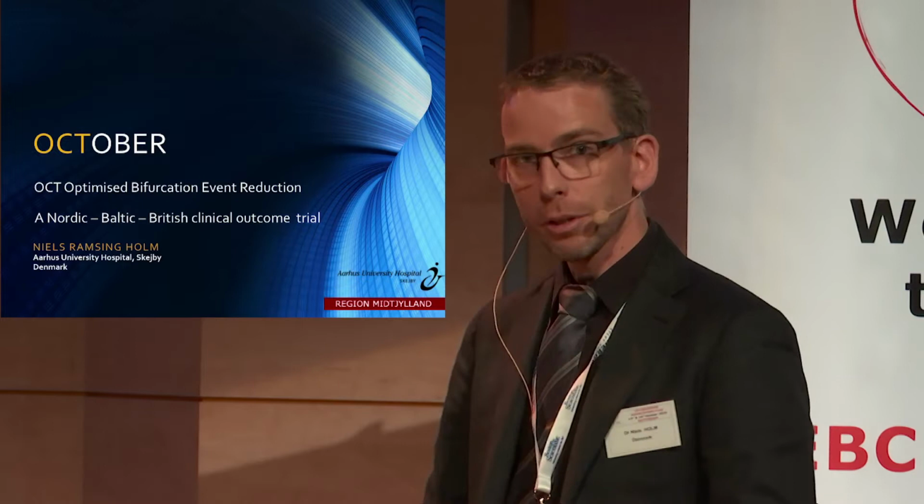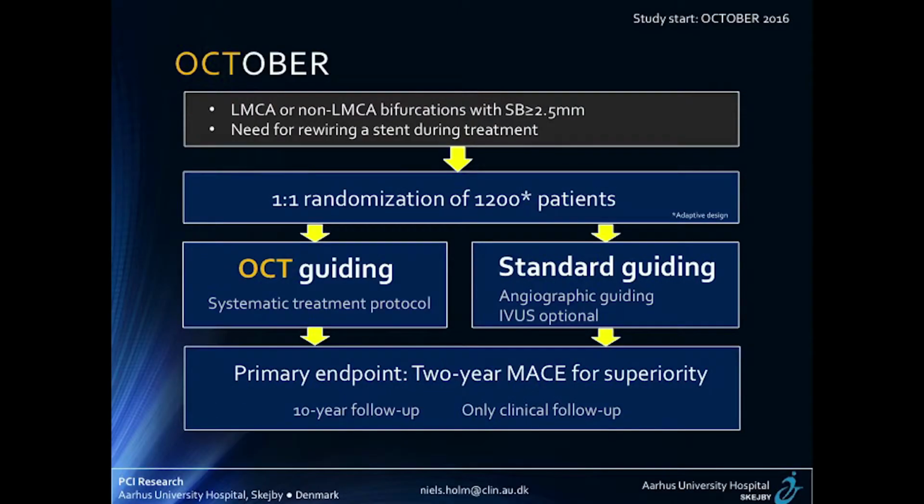It's a clinical outcome trial that will be performed in the Nordic Baltic countries and in the UK. I think in the last sessions here we have really seen the previous speakers building the case for OCT, and I think we now have really mature tools and a lot of knowledge about how to use this technology. So the next step should be to show if it actually works. Do we improve clinical outcome using an OCT-guided strategy compared to our standard strategy?